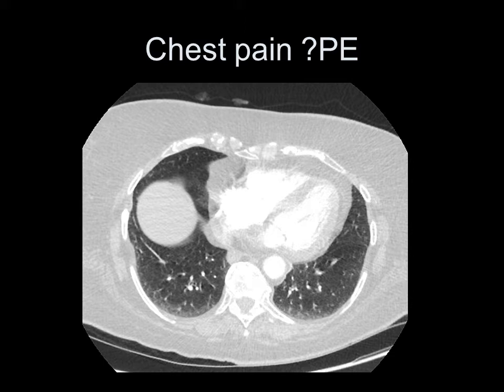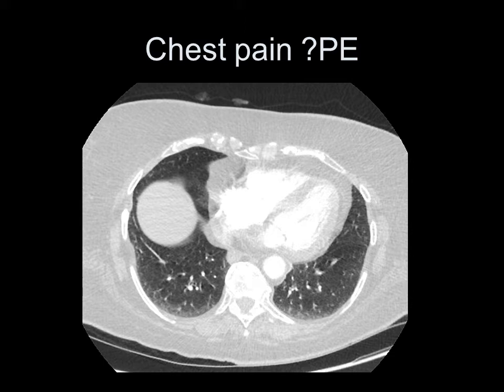I just want to speak about this process. If we look at the lung bases there is a sort of increase in density in the subpleural regions. Most of us call this dependent change. If we do mention it, we should generally identify it as being normal — I usually say 'dependent change, likely not significant' or don't mention it at all.